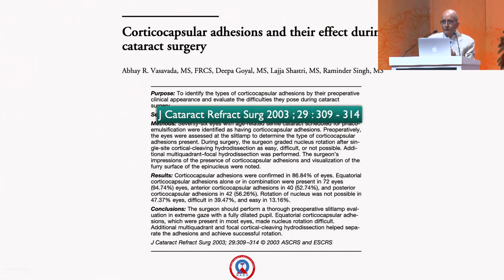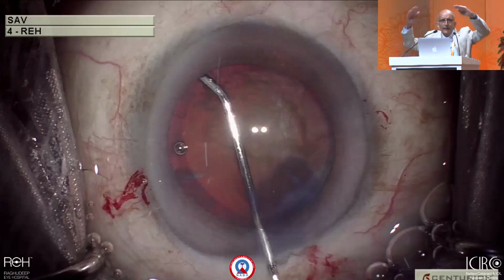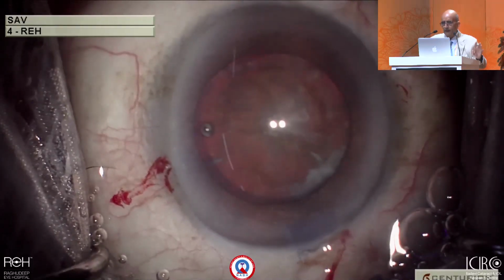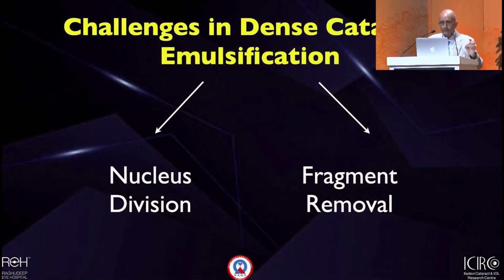And that's because of these corticocapsular adhesions that were described in 2003, more common in the white cataract, dense cataract, younger people, cortical cataract, and so on. So I use this Akahosi modified locally made cannula, which I find useful. Whatever you're using, bend a little bit towards the curvature of the lens, not the classical teaching of cortico-cleaving hydrodissection where you tent the anterior capsule up. No, follow the curvature of the lens, a little down, and very gentle hydrodissection. And if I'm happy, you can't see the wave, and don't try to see it also, you will never see that. So that's fine. This gives me an impression I'm okay, but it's a feeling, proprioception. If necessary, always be ready to repeat that. But I think it's important to do that.